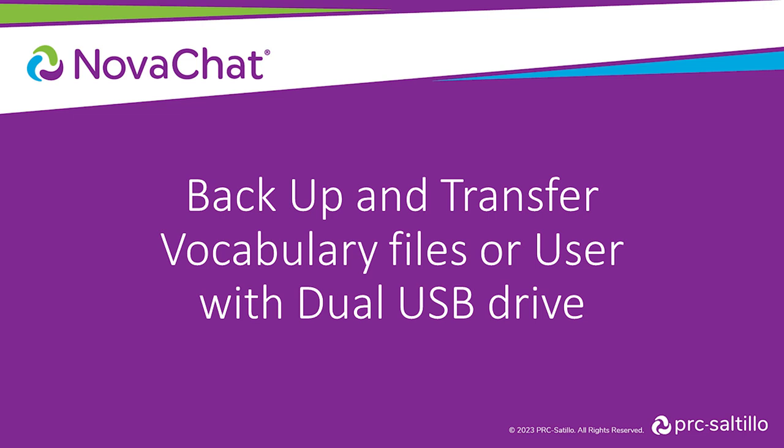There are many reasons why we should back up our customized vocabulary files on the NovaChat devices. Making sure we have a copy of the most recent file in cases of device repairs, sharing with staff and family to model on another device, or transferring customizations off the NovaChat at the end of a trial so that you can import it onto a purchased device.